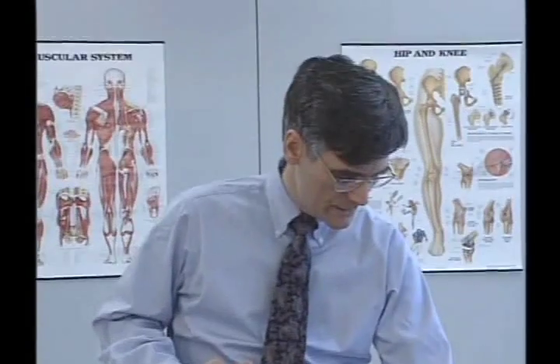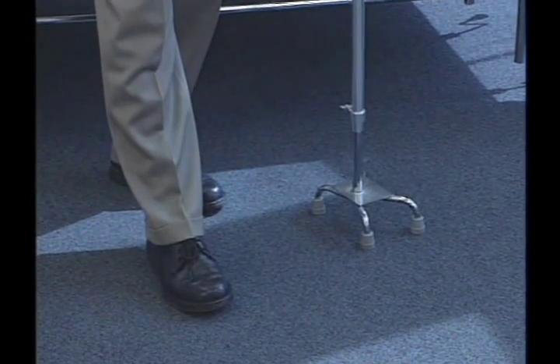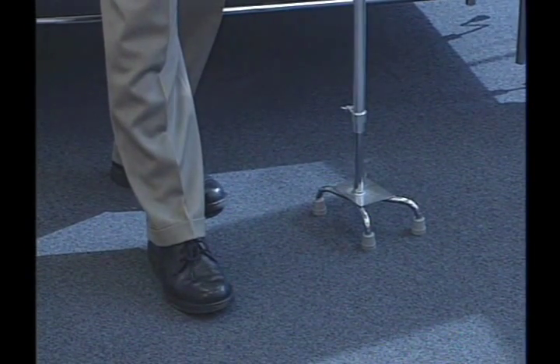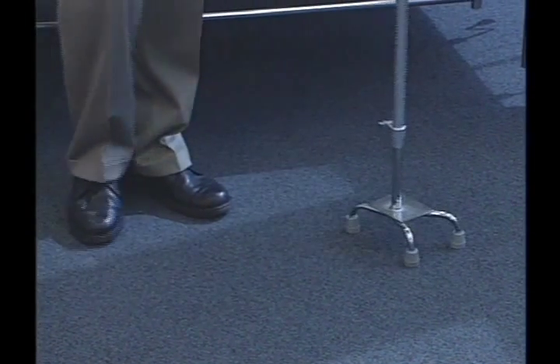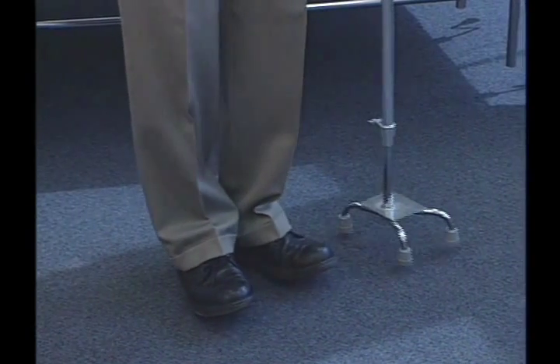So we use this cane by positioning it right across from the front, right across from the main part of the opposite foot — never in front like this. So it's the cane, the right, the left; the cane, the right, the left.